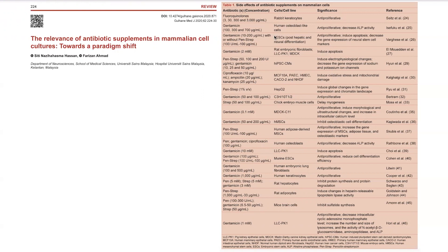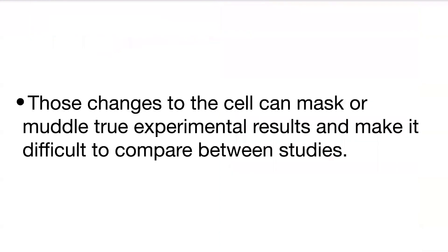Basically there are a lot of things that can happen to your cells even though antibiotics target bacteria — they can have these off-target effects on the cells you're growing. This can mask the true experimental results or make it difficult to compare between studies.